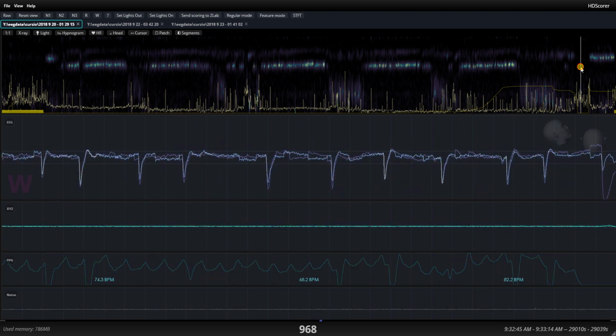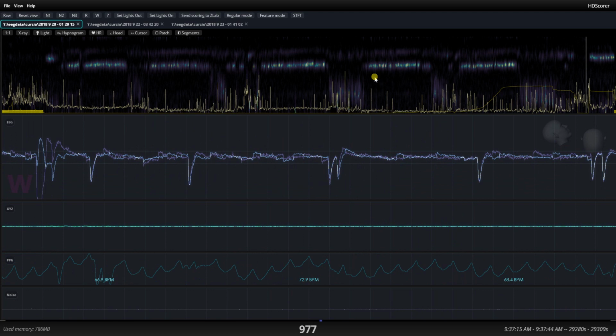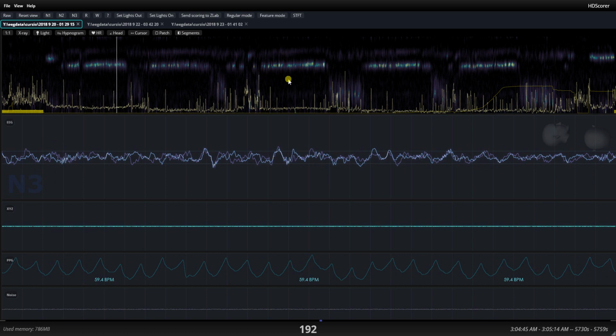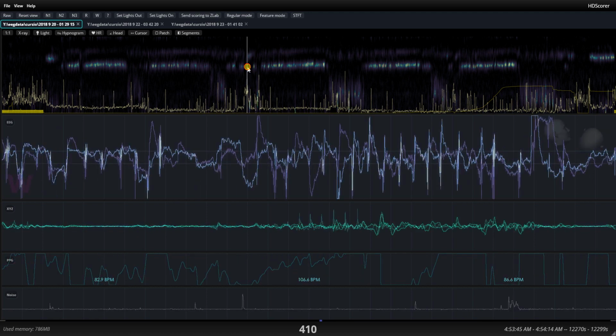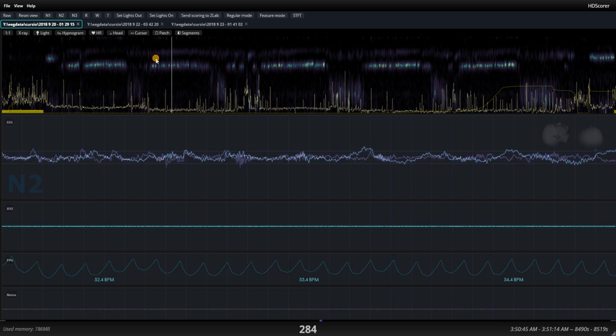Having all of these sensors together really allows you to look at the correlation between accelerometric data and the true sleep stages, or PPG data and the true sleep stages, and you realize quickly that the only real way to stage sleep is with electroencephalography. There's no way you get anything near accurate result using anything other than that. You can use these signals to add to the accuracy of EEG.